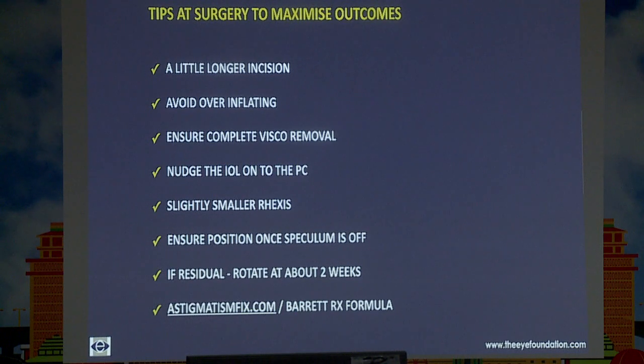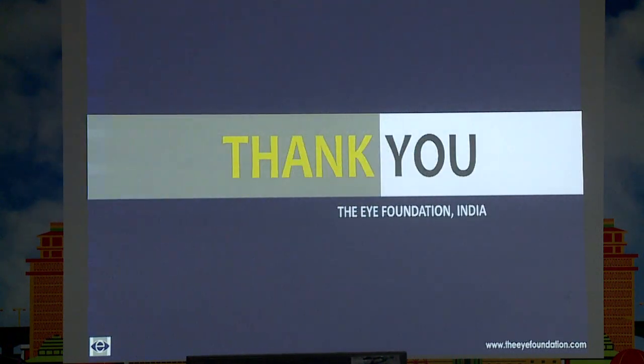Ensure that even after the speculum is off, the lens remains in position. And if there is a residual astigmatism, go ahead and rotate the intraocular lens 2 weeks after the primary surgery.